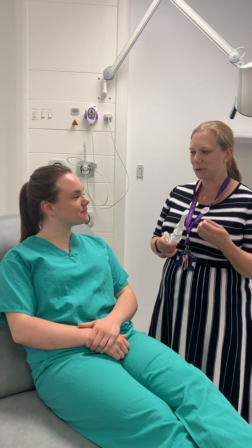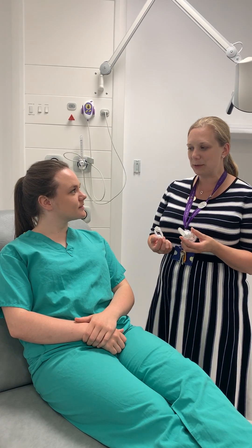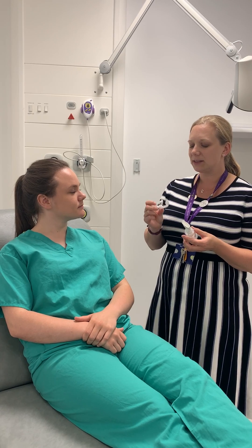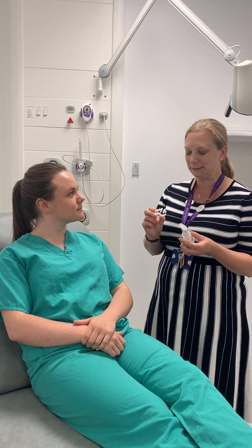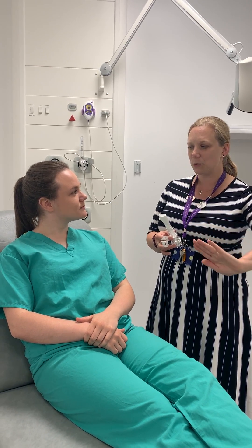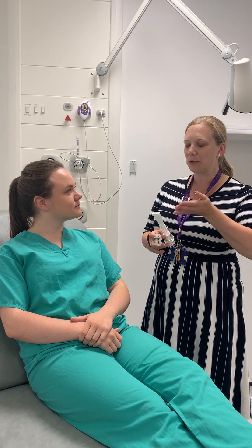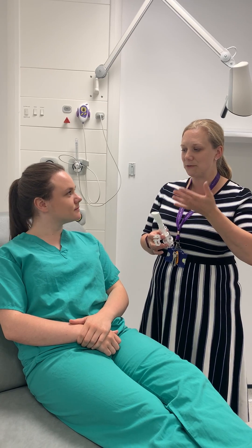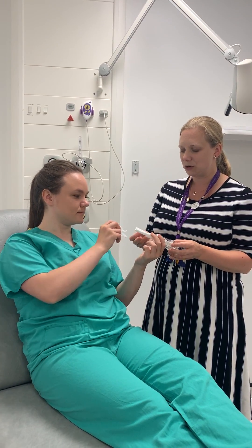Think of it as dumbbell training but for your breathing muscles. Getting a good technique is really important, so I'm going to get you to put the nose clip on because that will stop you cheating. To really get good training of the muscles, you need to breathe all the way out and then take a nice slow deep breath in until you feel that your lungs are full. So pop the nose clip on.